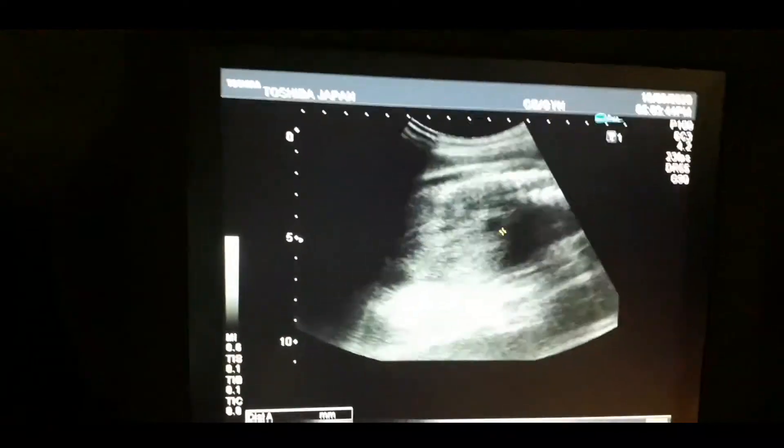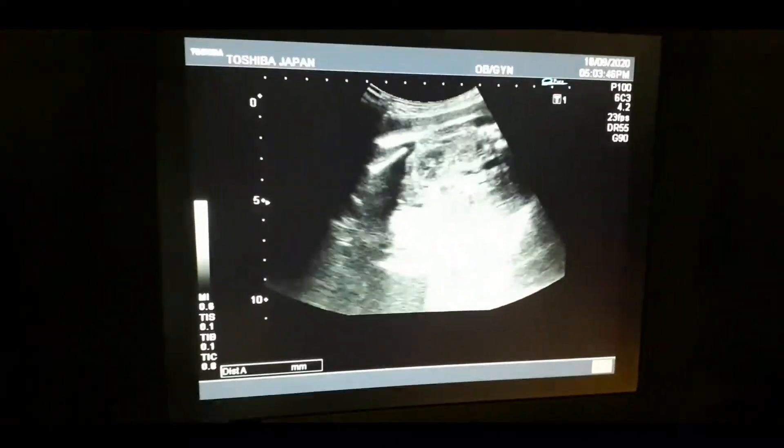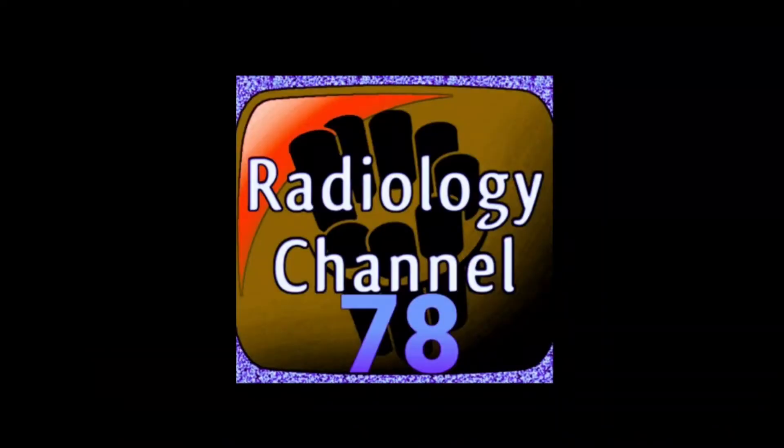This is the live case of the fourth chamber heart of the fetus.